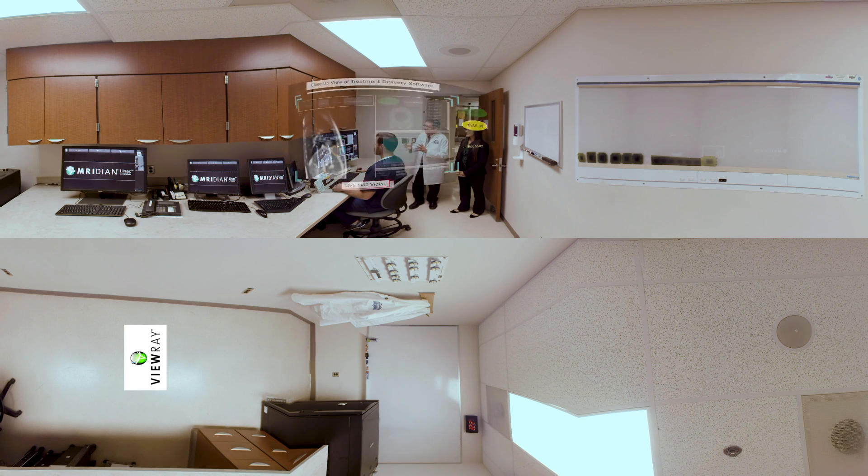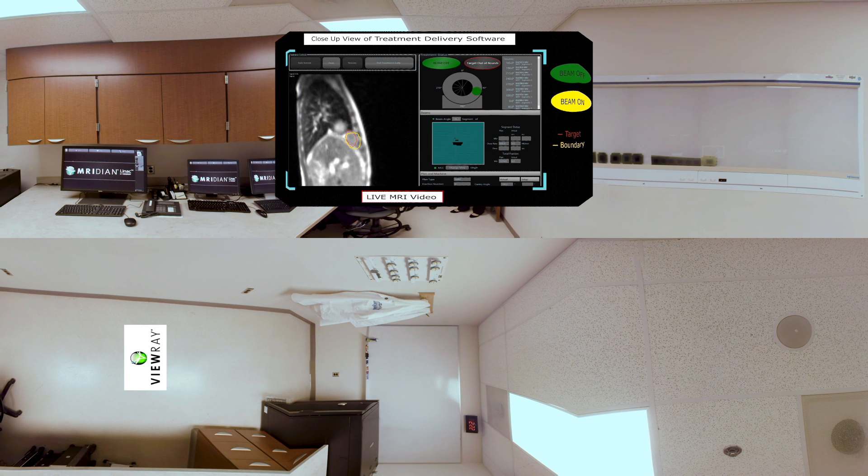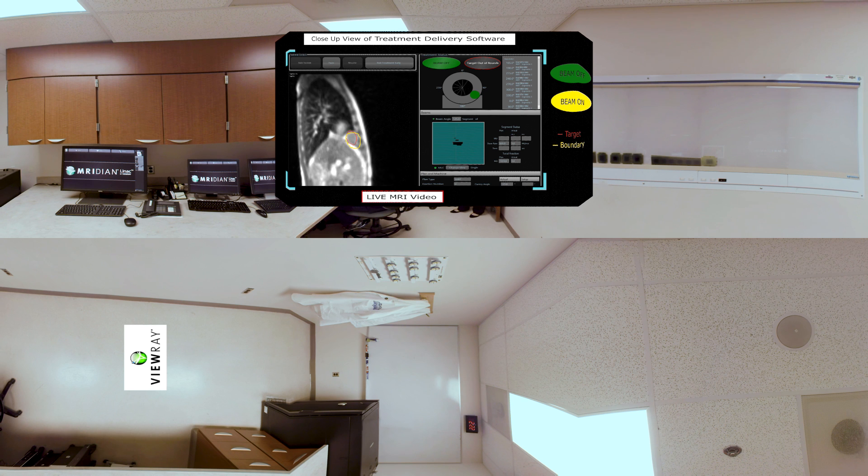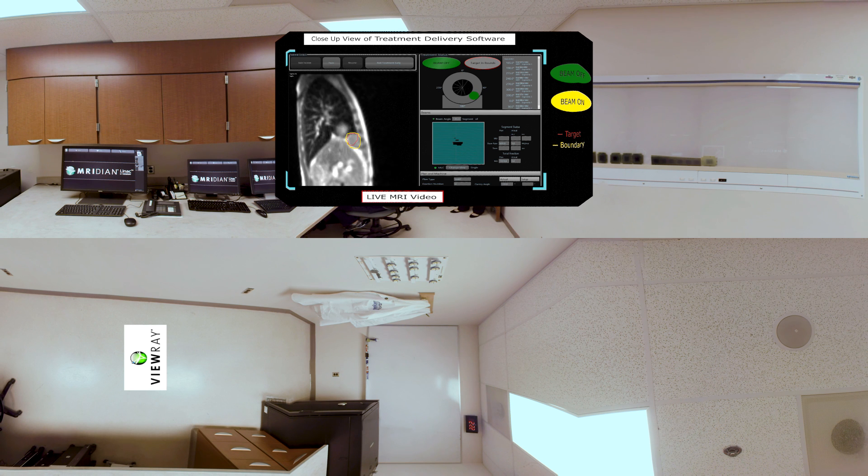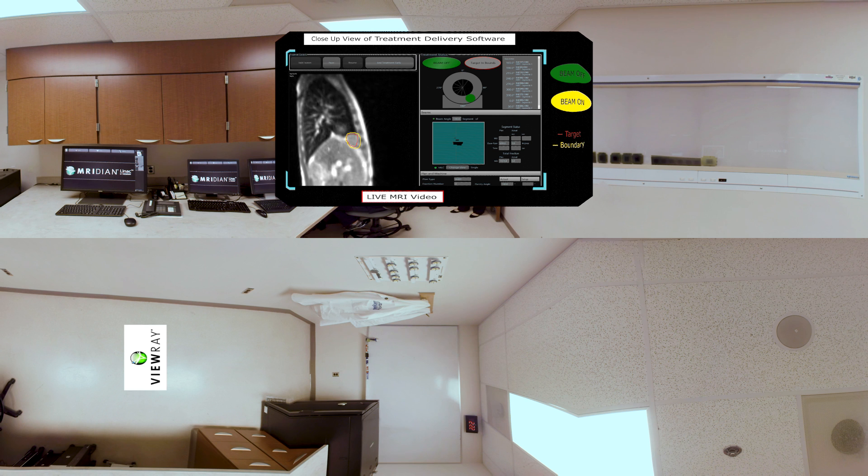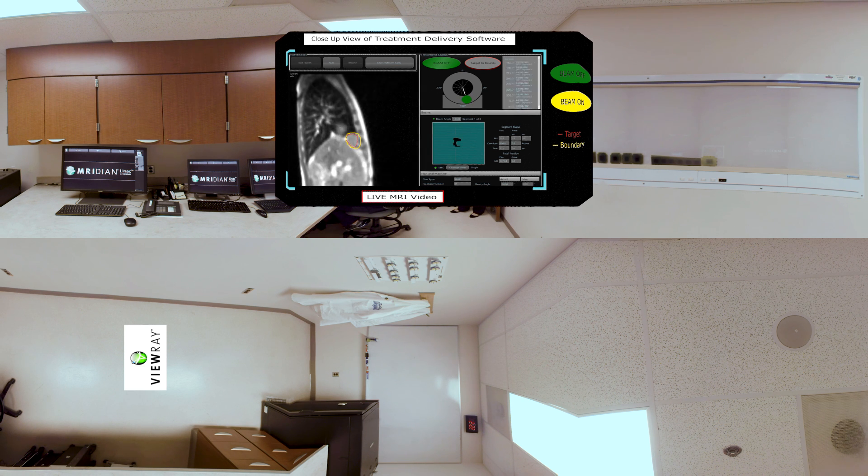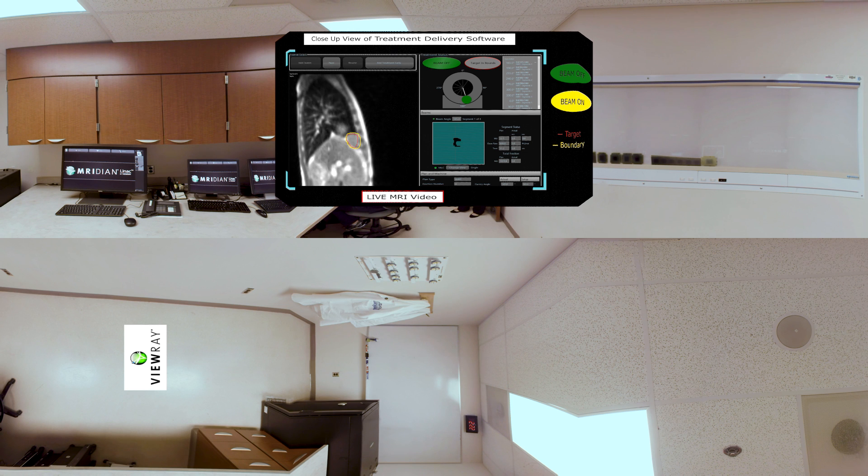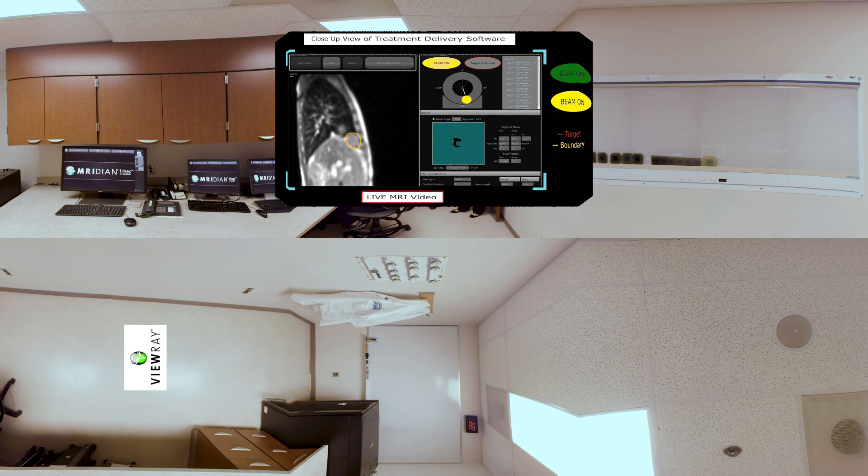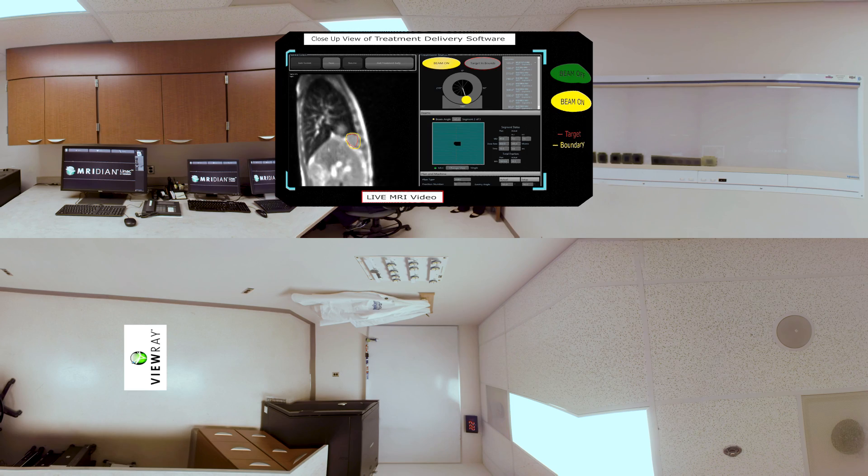You can see here that the patient is free breathing and things are moving all over the place. But now the patient actually, we're using gated treatment where the patient is holding her breath right in the position that we want. And we're able to turn the beam on. And if the area is out of the area, then the beam will temporarily pause. And then as soon as the patient's back in that position, the beam is back on.